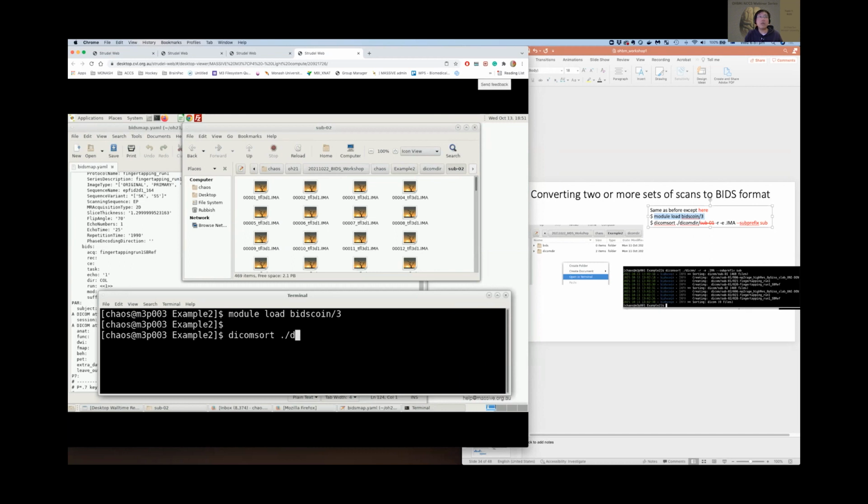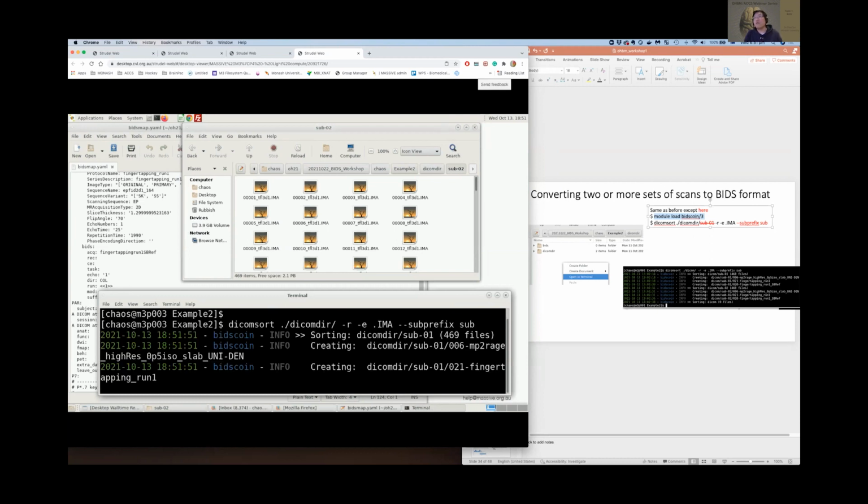Instead of typing in to specify which participant it is, I'm just saying, go searching all of the DICOM DL folders, right? And the -R, -E is the exact same flag as we saw before. And then here is the difference. It's a subject prefix, sub. It's pretty straightforward. Just say all of the folders with the prefix of sub will be considered as the folder they need to process. And it should recognize there are 2 folders and convert it for you.